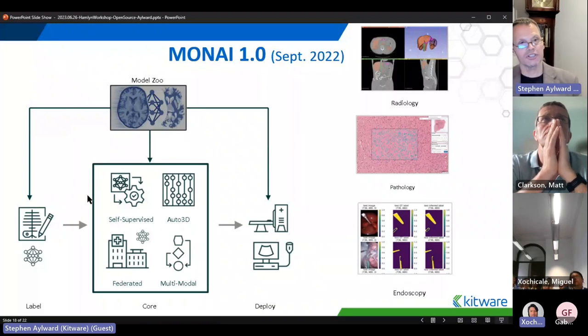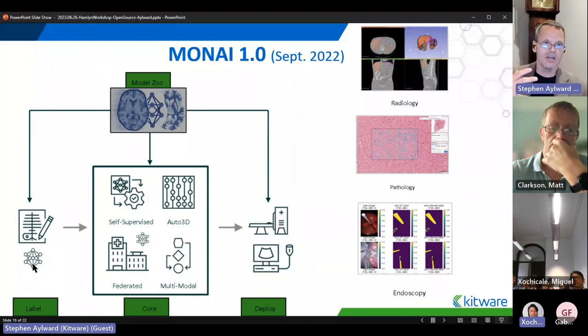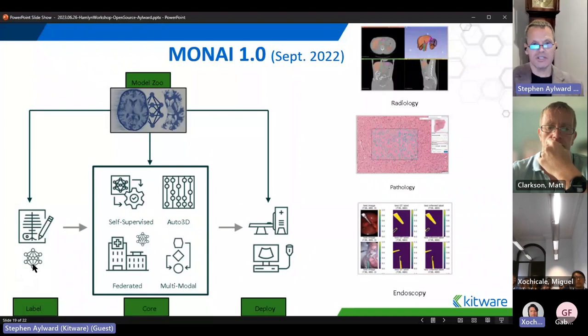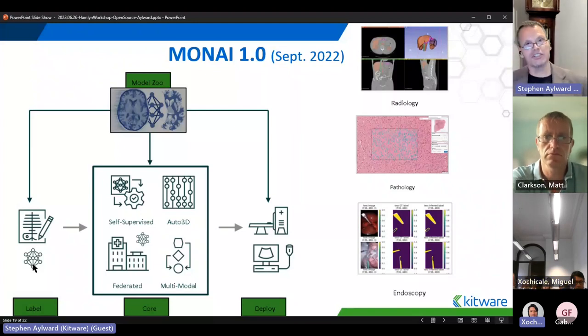And then the components of MONAI are shown here on the left-hand side. The main components are MONAI Label. This is AI-assisted annotation. These are Python-based methods that you can run within Slicer, for example, in order to have the AI pick a data set from your collection of data that an expert needs to annotate, and suggest an initial segmentation of that data, an initial annotation for the expert. The expert then edits it and sends that back to the AI. The AI improves its ability to do the segmentation. It learns from the annotation that the expert just did, and then picks another data set intelligently from its collection, saying, all right, given my current performance, here's the next data set that I want this expert to annotate so that my learning can progress the fastest. We're hoping to reduce annotation time and numbers by 75% with this AI-assisted annotation system that we have.